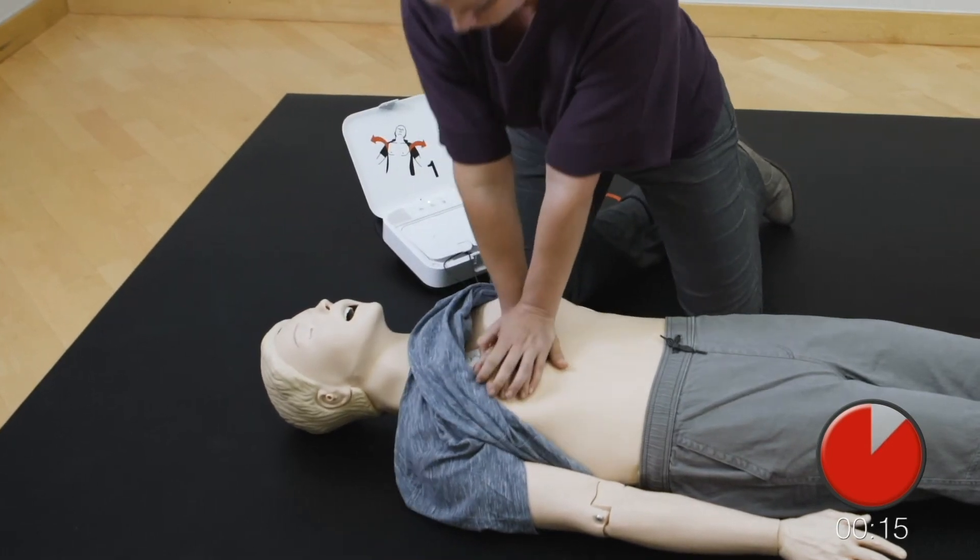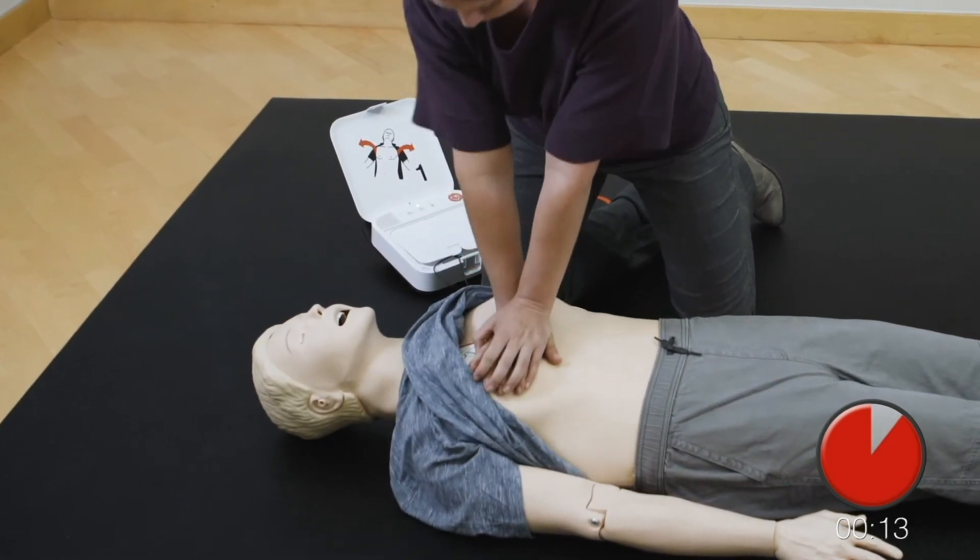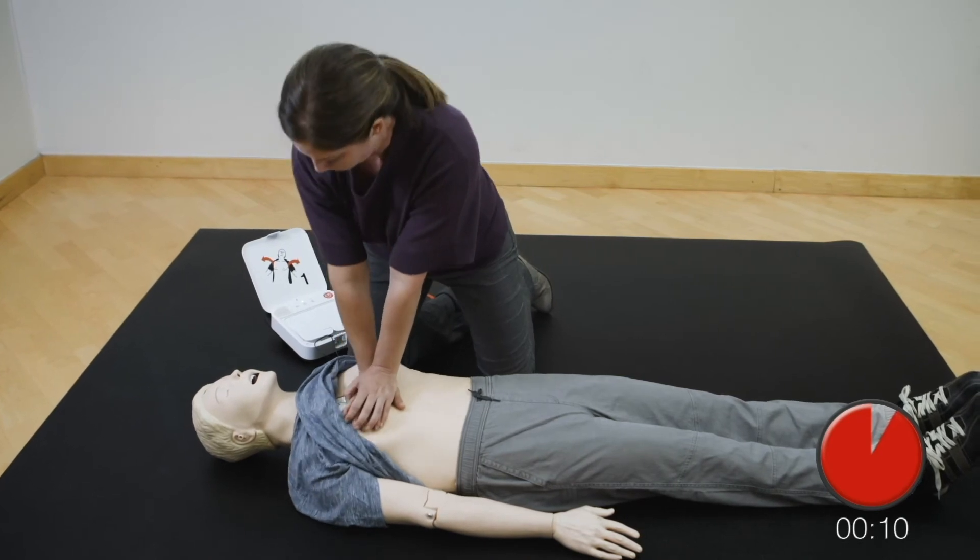Resume chest compressions. Push down hard at least two inches.